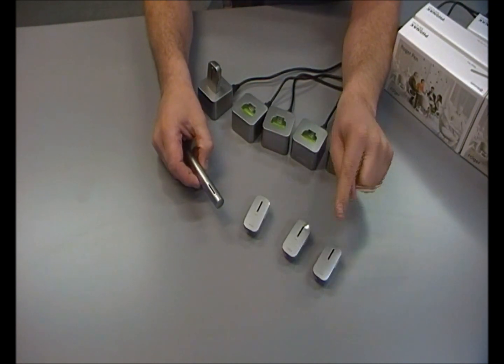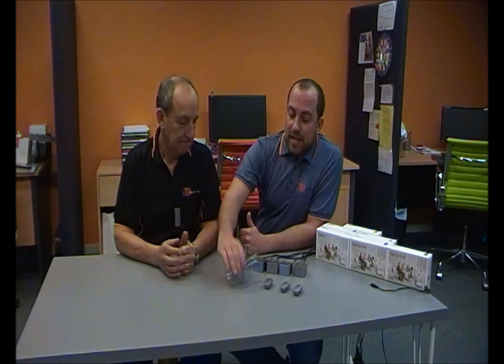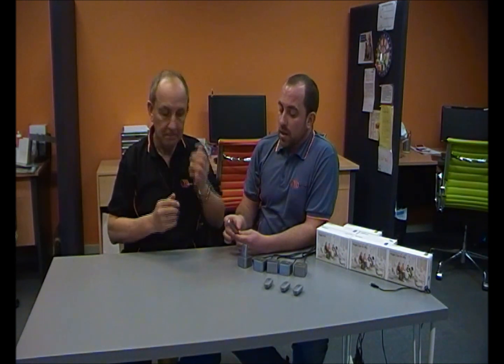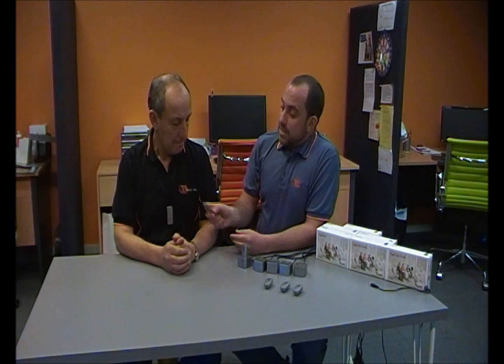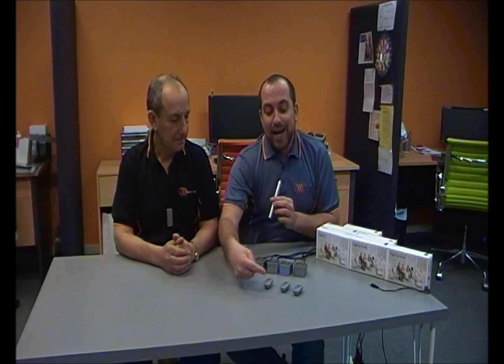This setup now has three clip-on microphones plus the Roger pen connected to the multi-talker network. Now that we've set up the Roger multi-talker network, we need to connect the Roger pen back to Bob's MyLink receiver. Bob, turn on the MyLink receiver, making sure we've switched over to the telecoil position on both speech processors. I press the connect button and Bob should hear a beep in his processors to confirm that connection is active. He can now hear my voice from the Roger pen or any audio from the Roger clip-on microphones given to other people in the room.